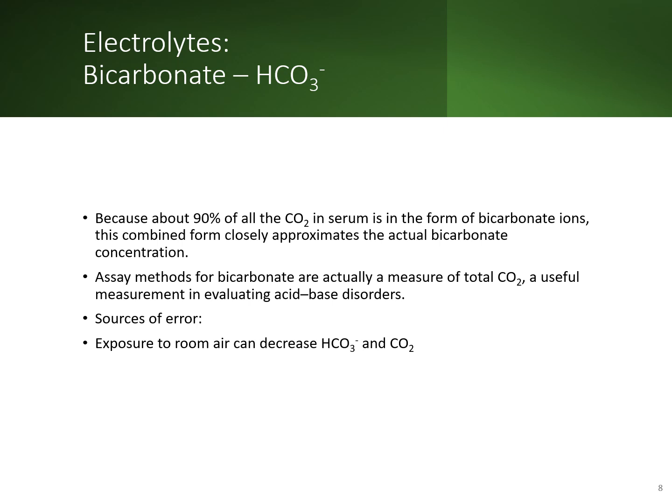A bicarbonate measurement is actually a CO2 result. Because 90% of all CO2 in serum is in the form of bicarbonate, by measuring CO2 you get a very close approximate of what the bicarbonate concentration is in the sample.